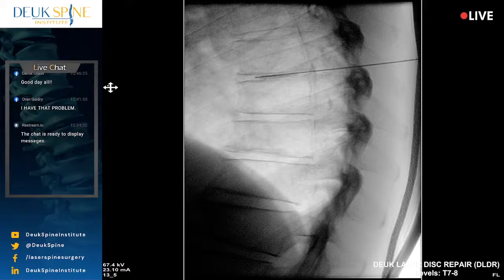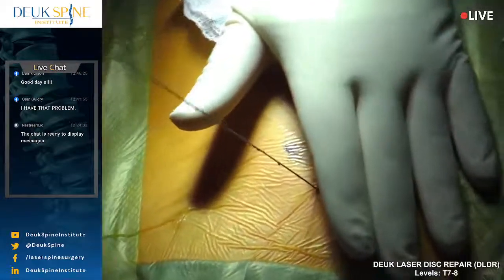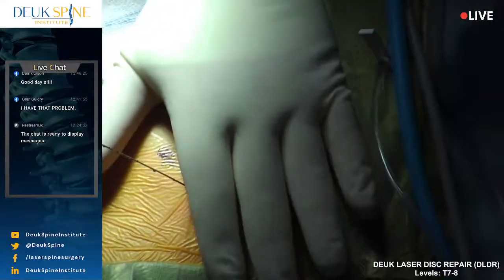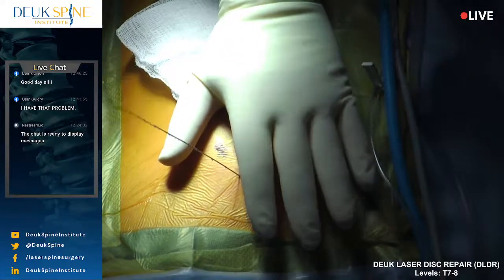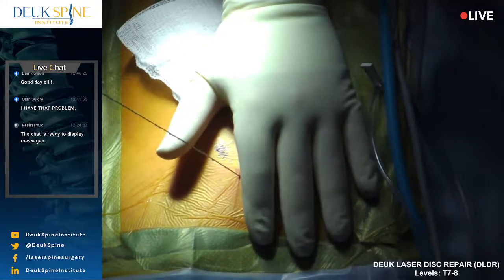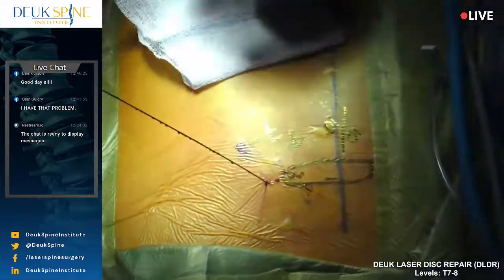we lost maybe a drop of blood for the surgery. Let me tell you, thoracic disc herniations are taboo in the spine world. No one touches them because they're scared to death of spinal cord damage and CSF leak. It's no man's land and no woman's land. I don't mean to be sexist, trust me.